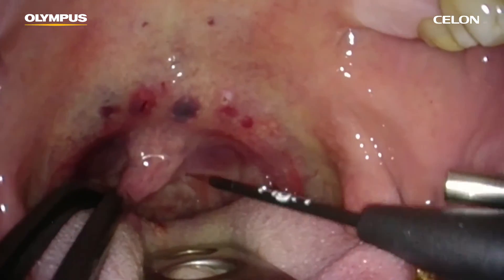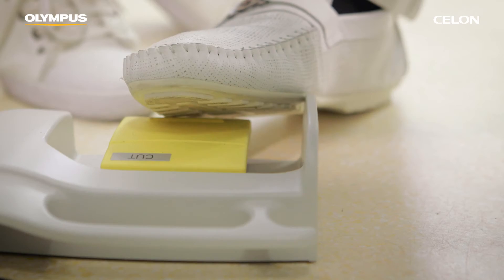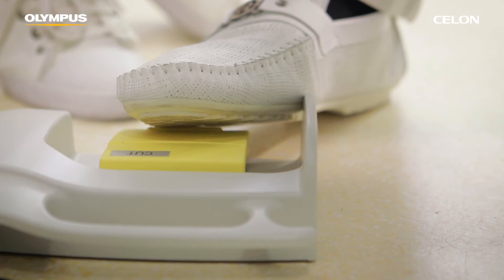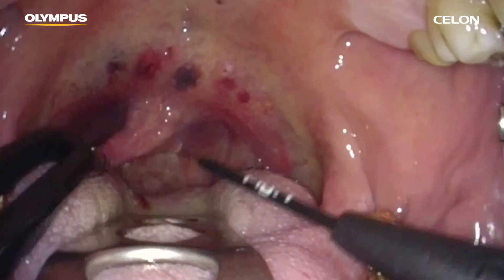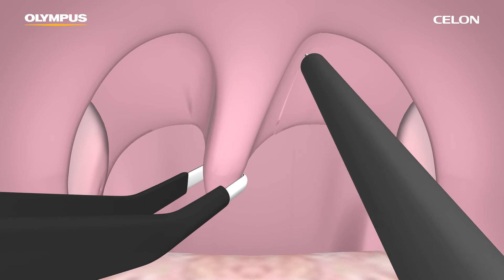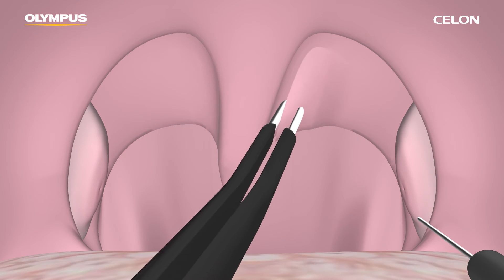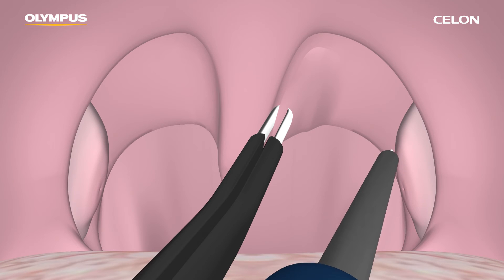First, take hold of the uvula with the forceps, which also serve as a return electrode. Second, activate the foot switch. Now the incision can start to be made with the cutting electrode. It is recommended that the resection of excessive mucous membrane is performed as a rounded shape on both sides of the uvula.